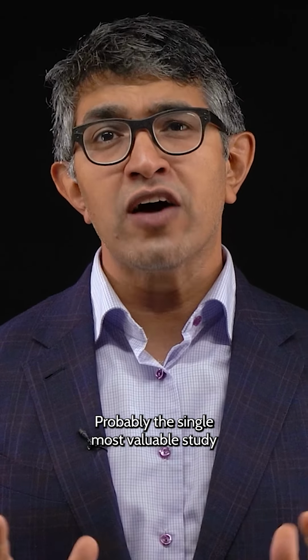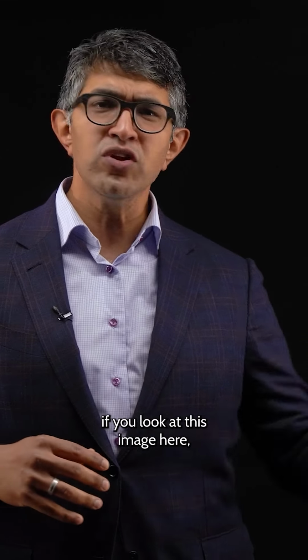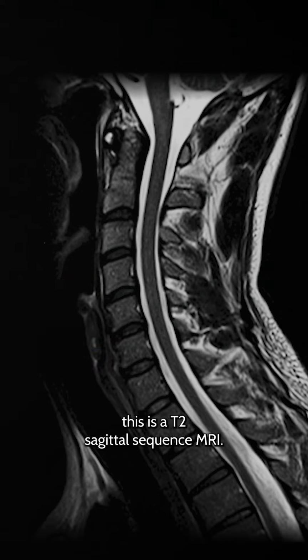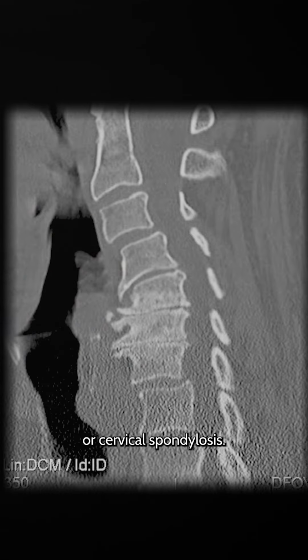Probably the single most valuable study that you can get of the cervical spine is the cervical MRI. So for example, if you look at this image here, this is a T2 sagittal sequence MRI. But then not everybody has to be traumatic. You can often find people, this is a CAT scan through somebody with just advanced degenerative disease or cervical spondylosis.